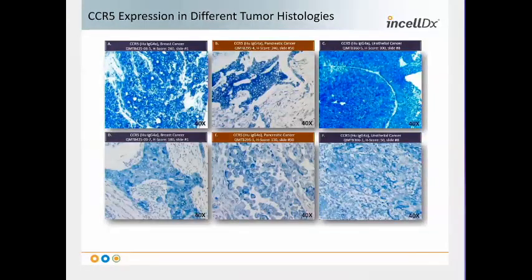And again, we see beautiful staining in blue with this conjugate from BioLegend labeled with a fluorochrome that we can then stain for in tissue without the need for antigen retrieval. So it's truly quantitative, both at the cellular level and on the tissue level.